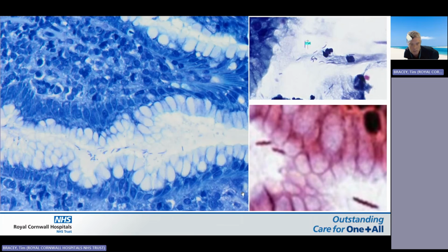I think 60 to 90% are H. pylori positive, and actually most of the remainder H. pylori is never found, but eradication does still cure them, or at least put them into remission. So heilmanni, I never know quite how to pronounce it, are pretty rare, and sometimes linked to dogs and cats, and sometimes people that live on farms and things like that. It's a zoonotic organism, but in this particular case, I was able to find it in the context of a MALT lymphoma.